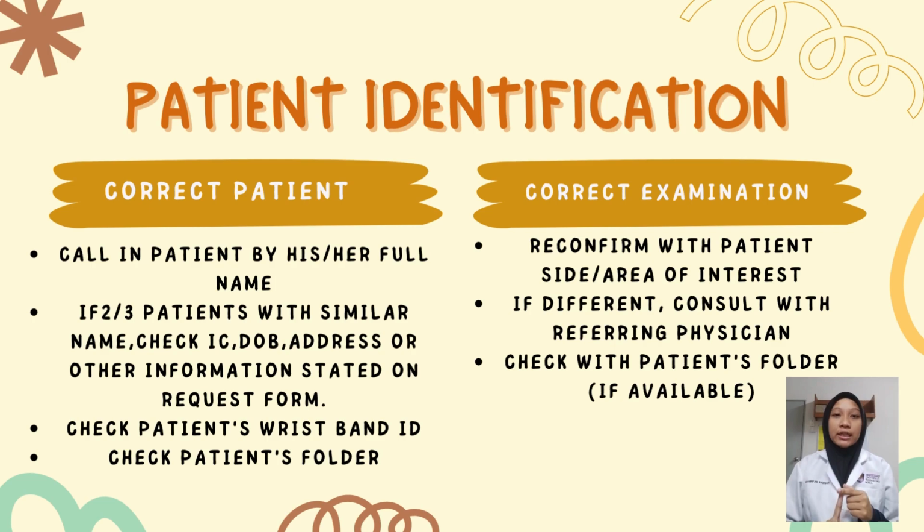First, call in the patient by his or her full name. If there are 2 or 3 patients with similar names, check their IC, date of birth, address or other information stated on the request form. Or you can check the patient wristband ID or the patient's folder.